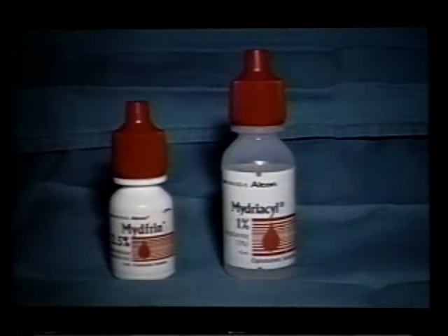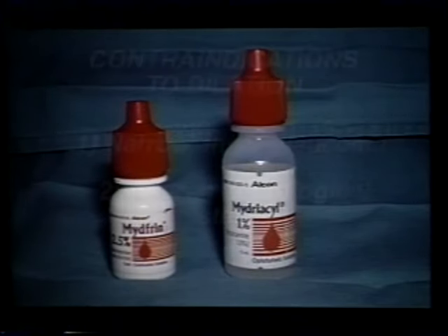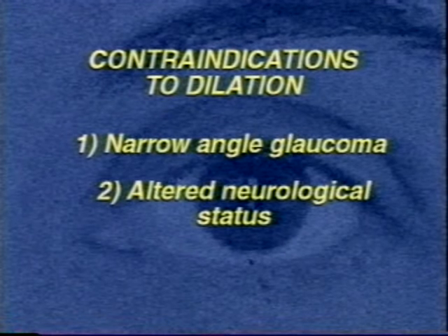Next, you will perform direct ophthalmoscopy to assess your patient's ocular media and retina. Dilating drops should be used because they give you the best view of the retina. There are only 2 contraindications to using dilating drops. 1, narrow angle glaucoma, and 2, an altered mental status that requires periodic assessment of the pupils. These complications can easily be managed in a medical setting.